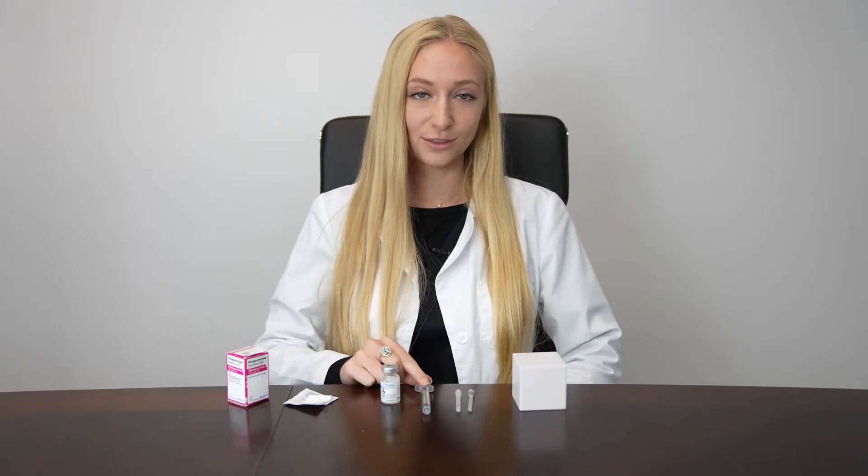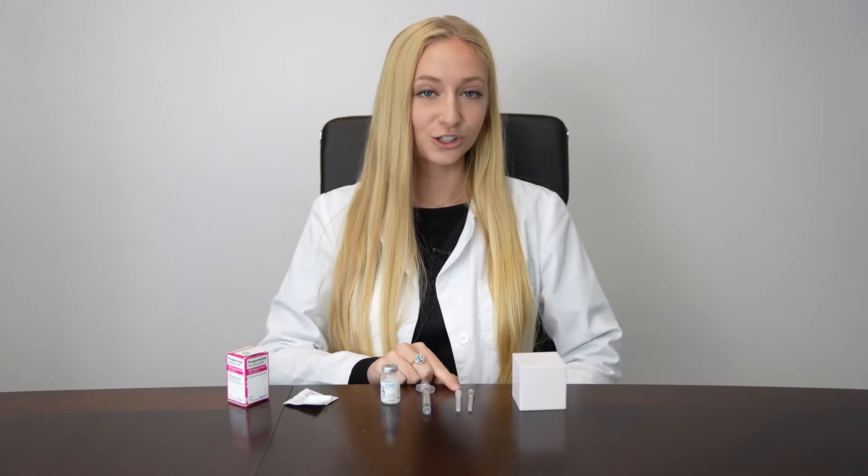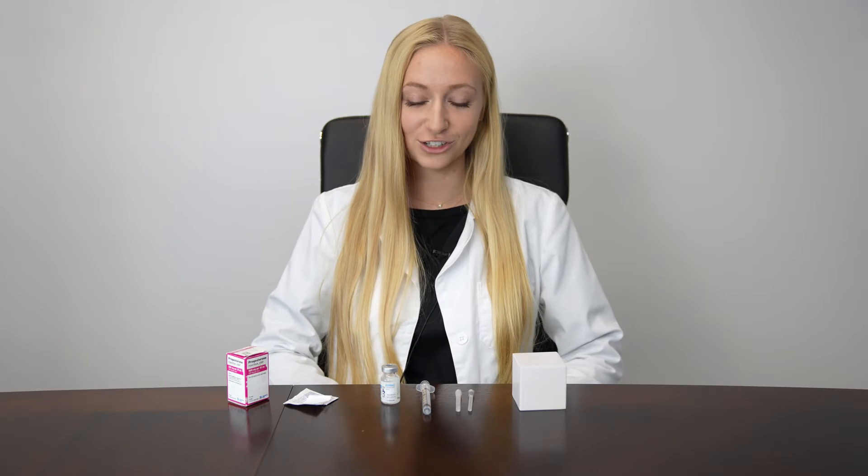The concentration in your vial should be 500 milligrams per 10 ml. In addition to your vial of progesterone in oil, you should have a 3 ml syringe, a larger 18 gauge 1½ inch needle for mixing, and a 22 or 25 gauge 1½ inch needle for injection.